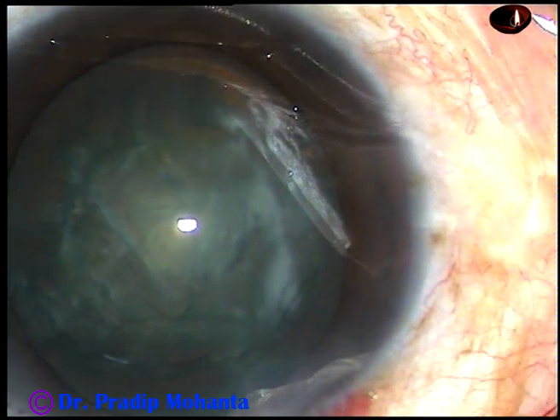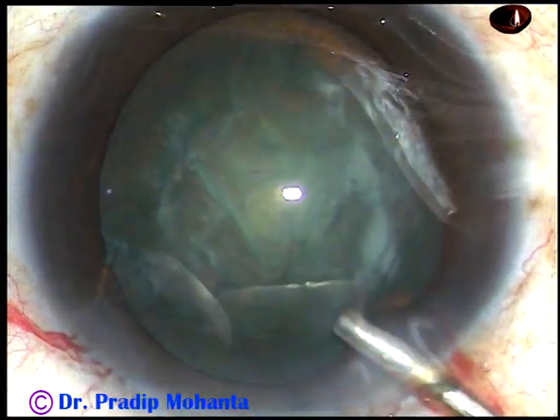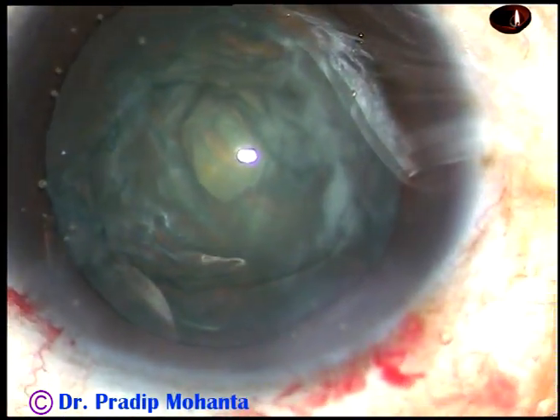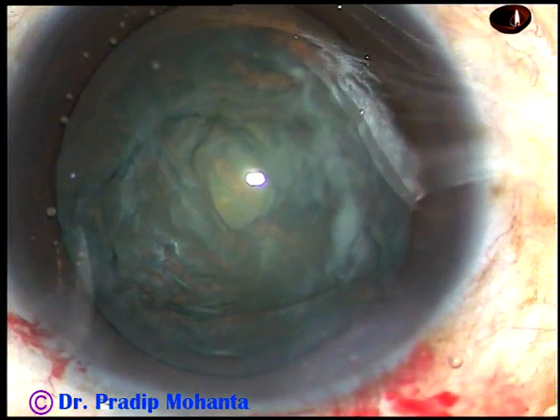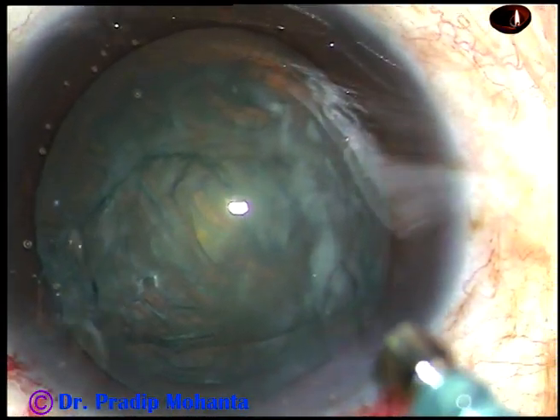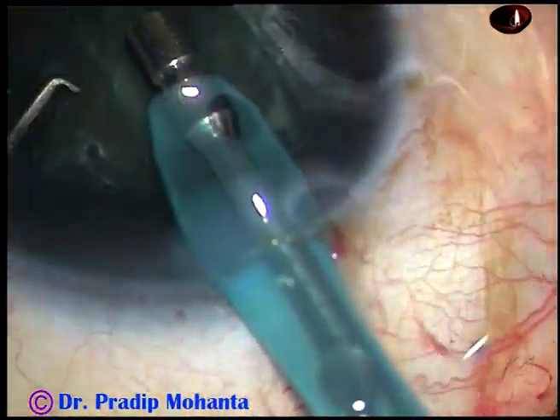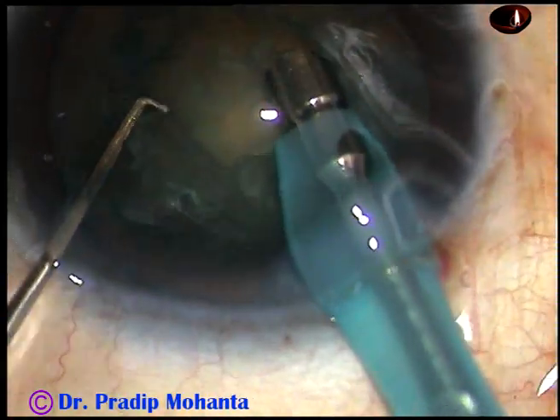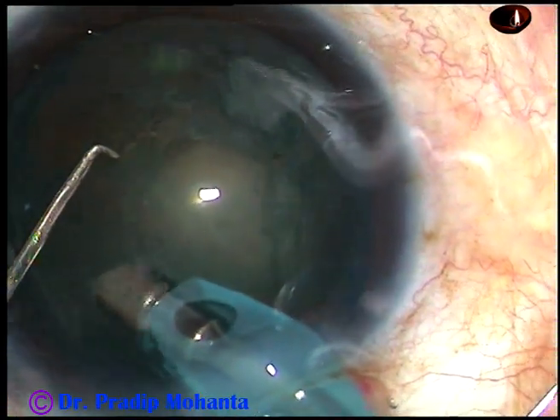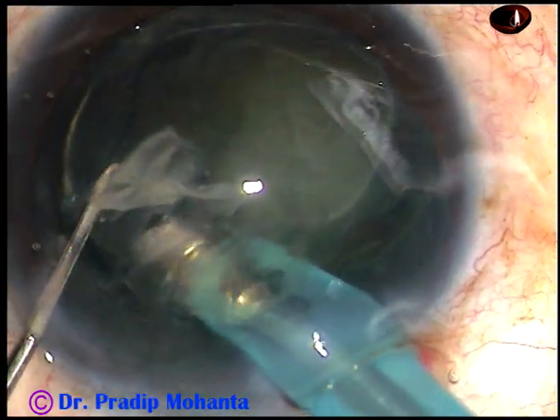Now is the time to introduce the tip of the FACO handpiece. 2% HPMC again. The tip is introduced with bevel down. I am in FACO 2 mode with 450 vacuum, 45 flow rate and 50% ultrasonic energy. Remove some superficial cortical matter. Place the tip facing the nuclear mass at 2 o'clock and go to position 3.